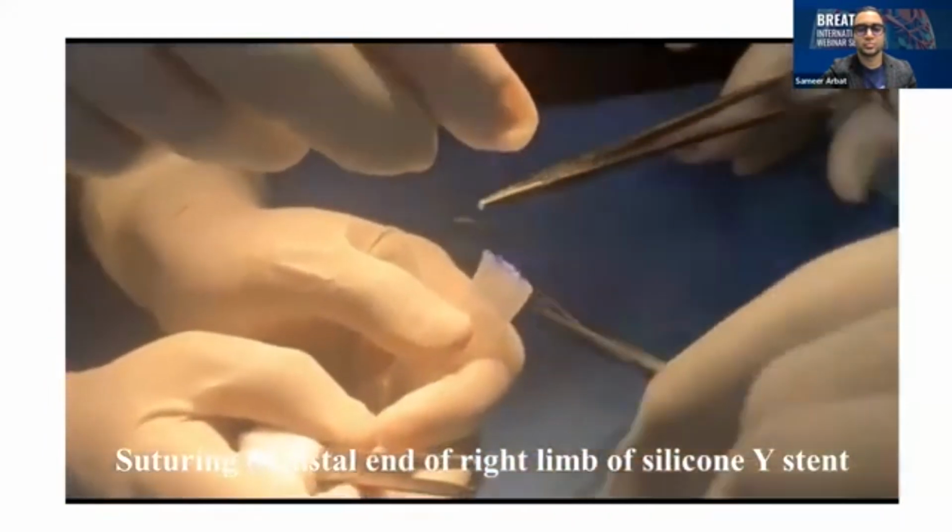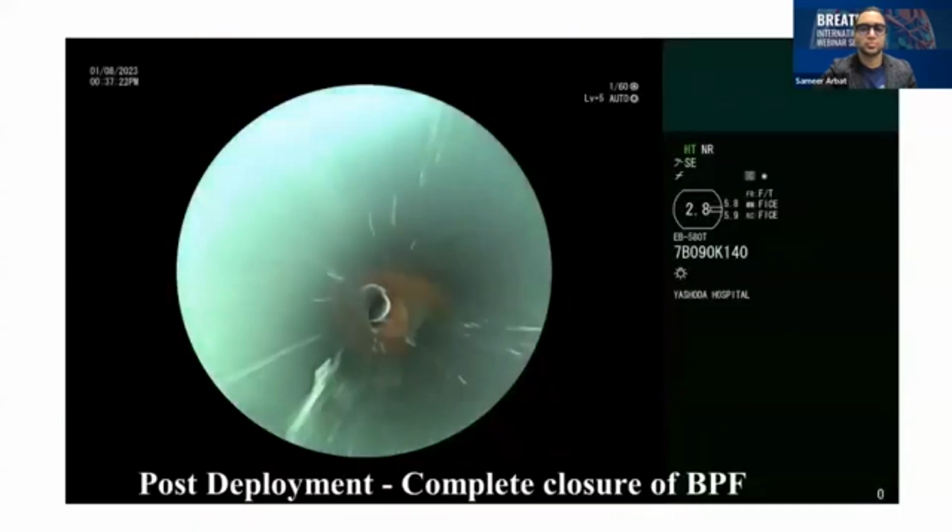So what we are doing is we are using the rigid bronchoscopy as a conduit, and all silicone Y stents can be placed only with the help of a rigid bronchoscopic assembly. And now you can see under real-time visualization, we are inserting the silicone Y stent.